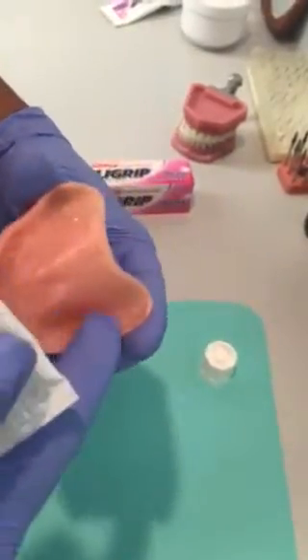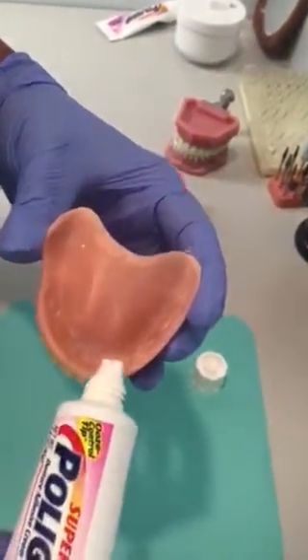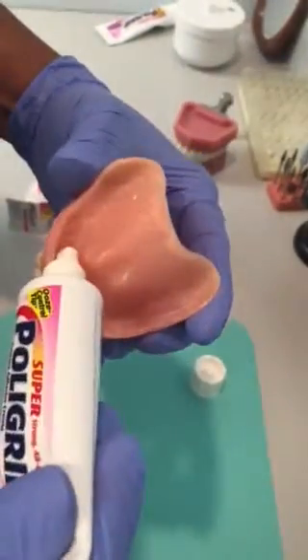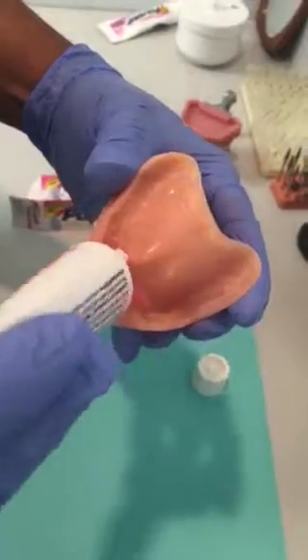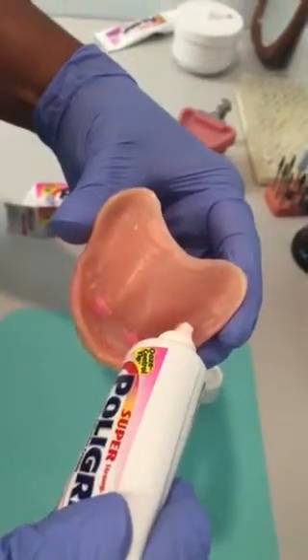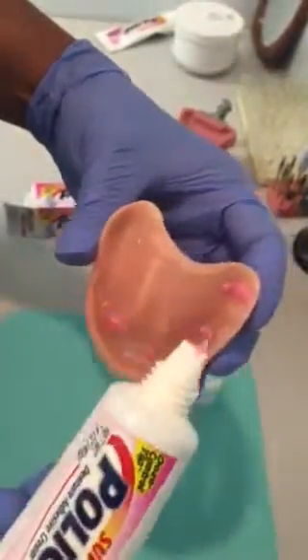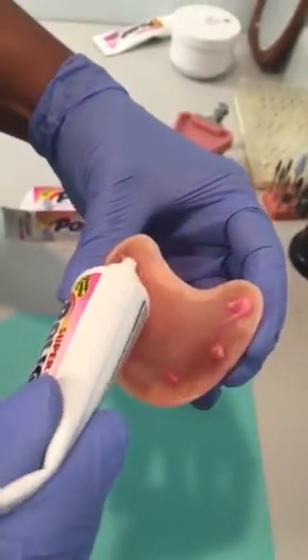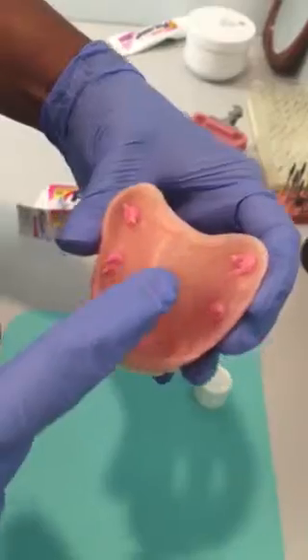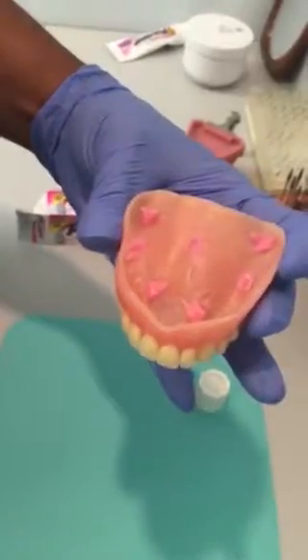For the upper, it sort of depends on the amount of bone in the patient's mouth. This seems pretty average. You place the same pea-sized drop in the area of the eye teeth — notice it's not a whole line, just a little drop — and in the area of the molars. Sometimes, depending on the amount of space, you can also use just a little on the palate.